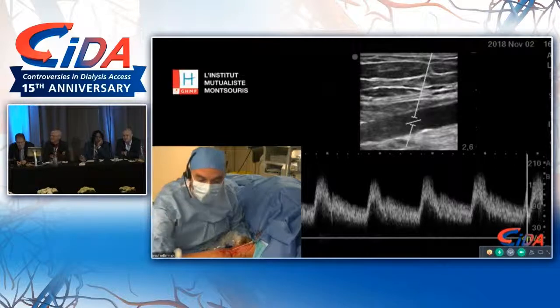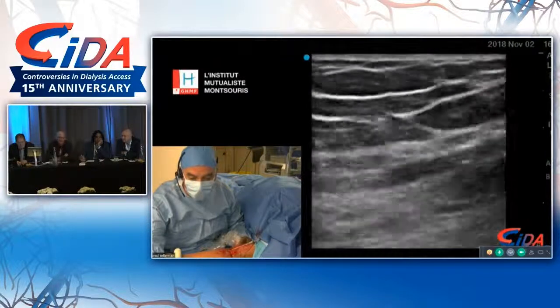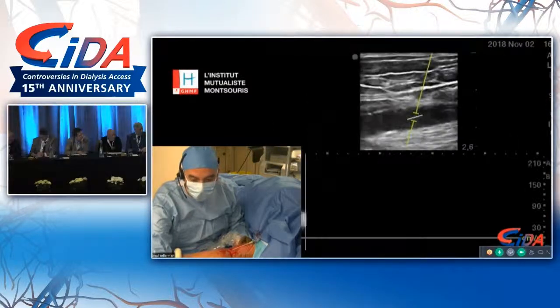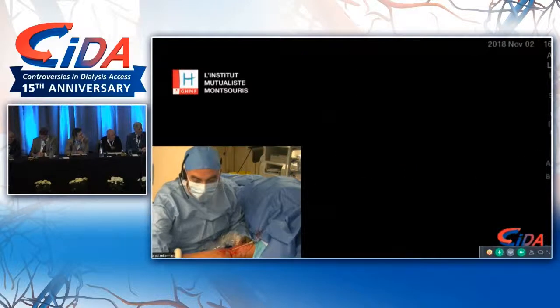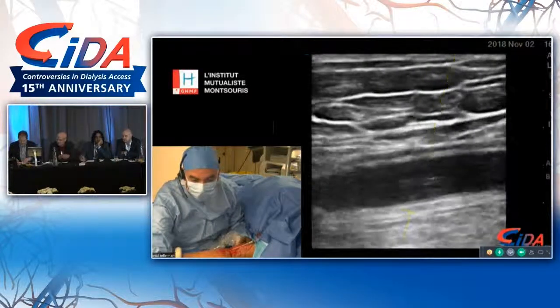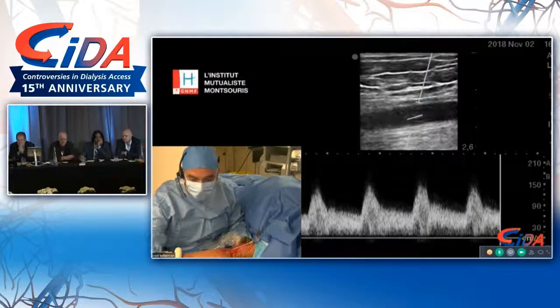Jeff, any comments about outpatient, inpatient, and so forth? Because the U.S. trial, I think, was all outpatient, wasn't it? Right, all outpatient. Alex says it took some 10 cases, but you have to realize that this method of going down transverse is not how we taught him. We taught him to put a wire down and to move the needle over the wire. So he independently developed this transverse technique during his, quote, training period. So, Alex, you've really moved this technique forward.